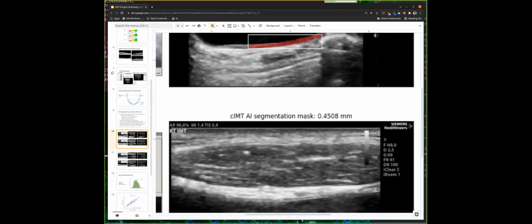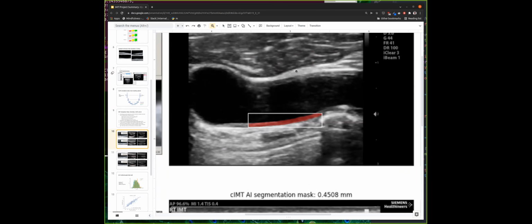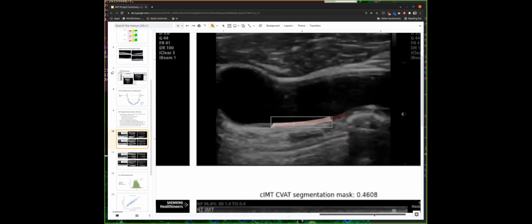There's a whole data set of results images that we can flip through one by one if you'd like. But yeah, this is a really typical example we see from the AI, where the shape looks really nice and clean. It looks very good to me. If you compare the CVAT, which is this kind of pink section, to what the AI did from its training model, it agrees very well. There's always a little wiggle room in how wide to make the image. I know that the SonoCalc one, I think, was clipped to be 10 centimeters, if I remember right, or 10 millimeters. But I guess as long as the thickness agrees well, it's fine.